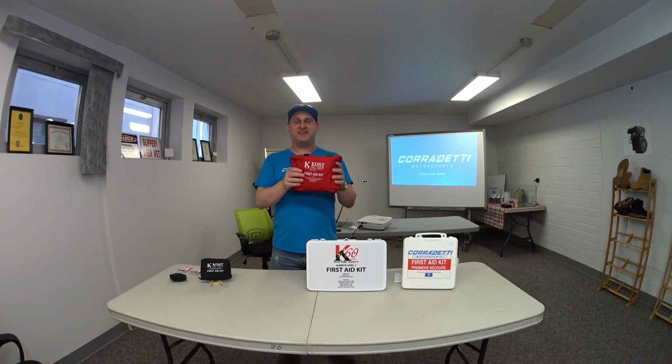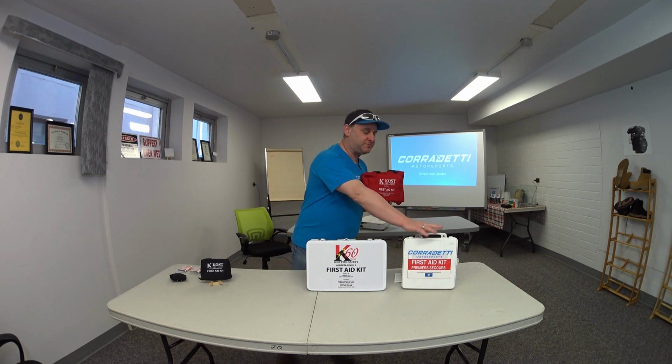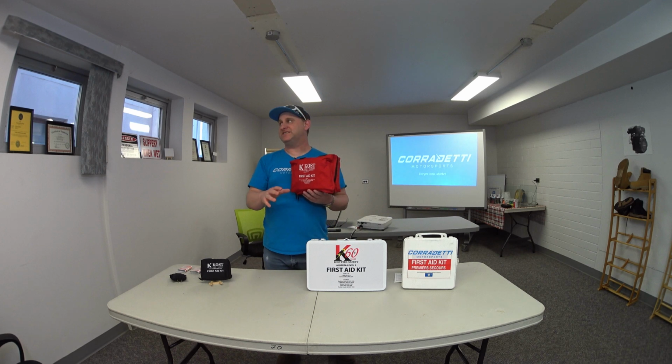It's light. If I have to carry it, it's not going to be heavy. It's not going to bang into anything. So you can look at your utility requirements. But in the level 1 bag, you can also move up to a metal case or a plastic case that's a little bit more water resistant.